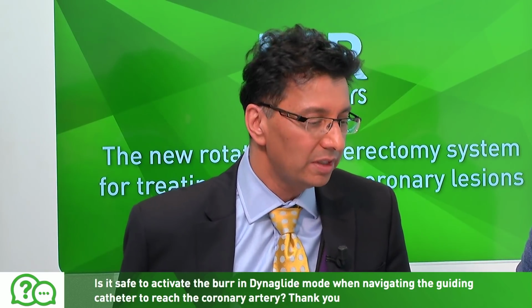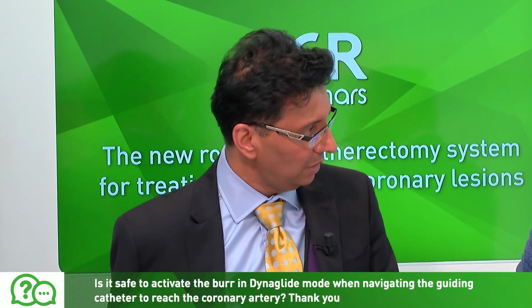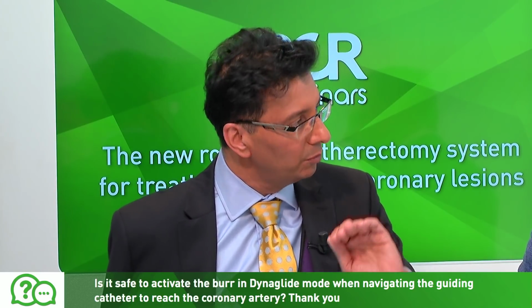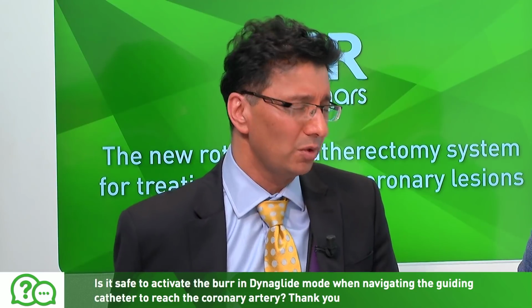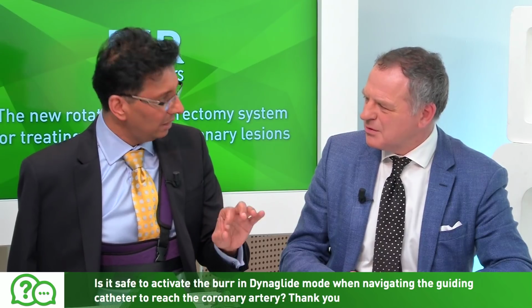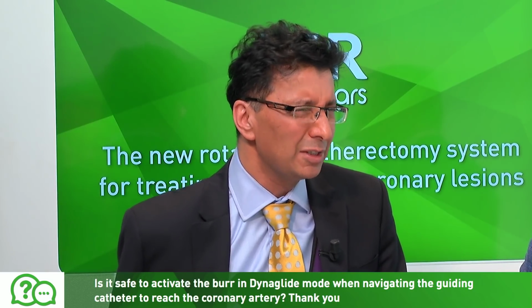The concern with that historically is that obviously the diamond crust is on the front of the burr, and any forward movement in the guide is going to potentially ablate the guide. And certainly there are case examples of ablating the end of a guide catheter with aorto-ostial lesions. So bringing the burr back with Dynaglide is perfectly reasonable, because the back end of the burr obviously doesn't have diamond crust and won't ablate the guide. And those are my views, and it's not really necessary, is my personal view.